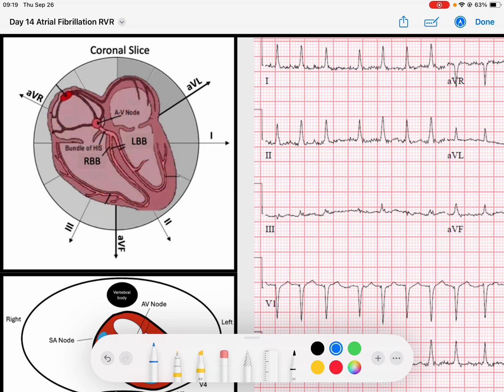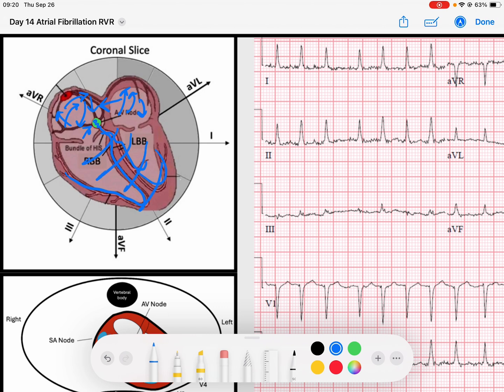In AFib, what ends up happening is you get signal in these micro-reentry circuits all within the atria, causing a poorly coordinated depolarizing wave through the atria over and over again. The AV node is getting bombarded by these signals. When the AV node decides to pass one of those signals down, we're going to get a normal QRS complex. But after that, the AV node has to reset and repolarize. The amount of time it takes for that AV node to repolarize is going to be evidenced in the rate of our rhythm.